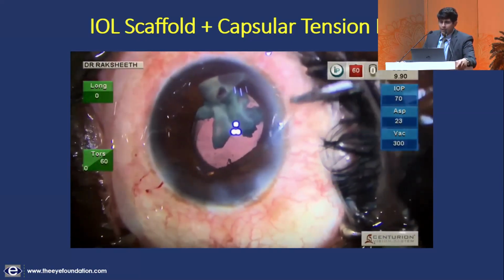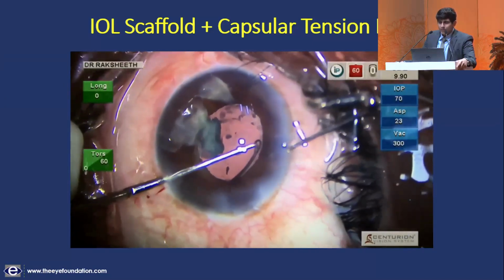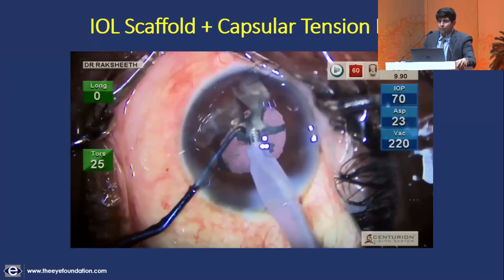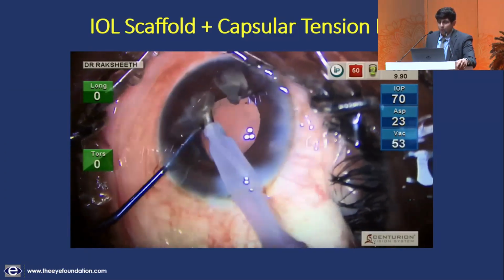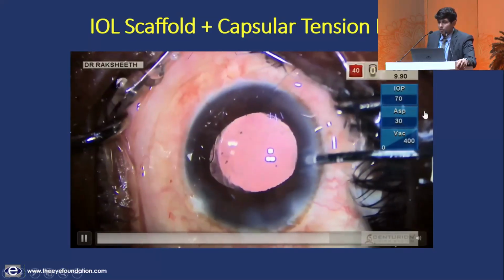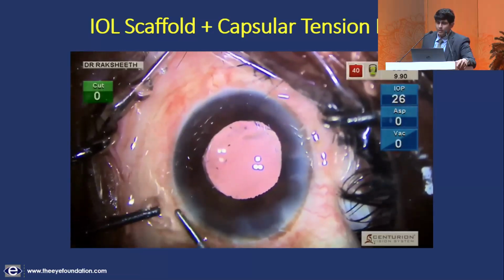I put in a capsular tension ring into the bag with the IOL already in place. And once this is done, I don't see this abnormal phacodynamic. I don't see the bag moving towards the phaco tip while I emulsify the remaining pieces. If one observes closely, you can see that there is peaking of the pupil at this point and the iris is prolapsing through the side port where the chopper is, and that's because the vitreous is already at this location.